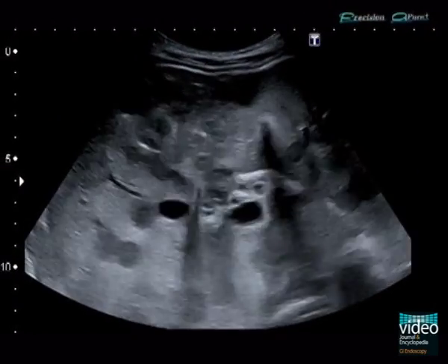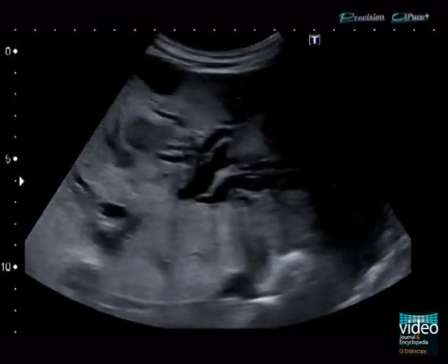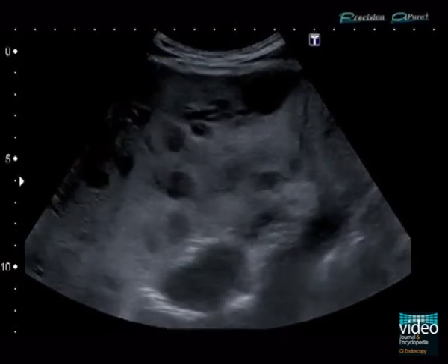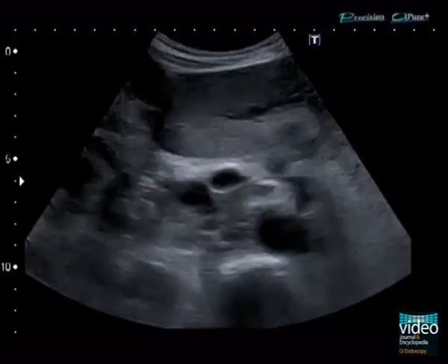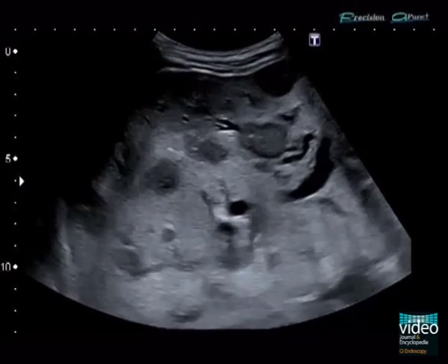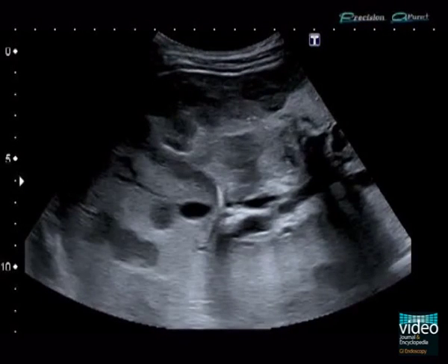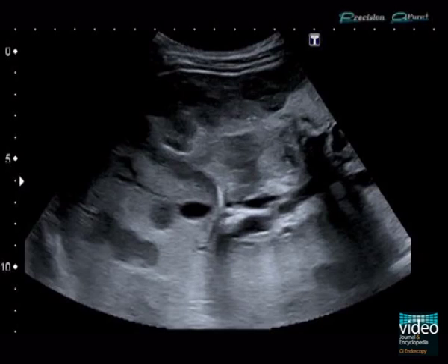In a patient with jaundice after previous Whipple procedure, ultrasound reveals dilated intrahepatic bile ducts in both hepatic lobes and, in addition, multiple hepatic and peritoneal metastases. Biliodigestive anastomosis could not be reached with an enteroscope. An alternative percutaneous transhepatic cholangial drainage PTCD for external bile drainage was declined by the patient.